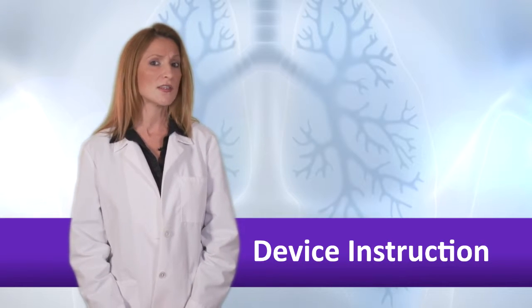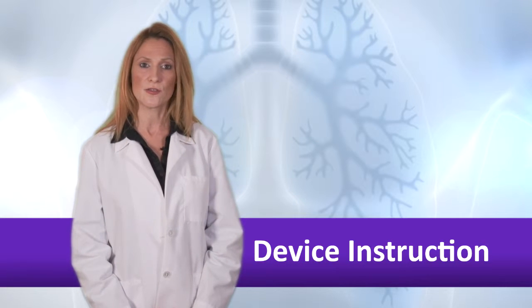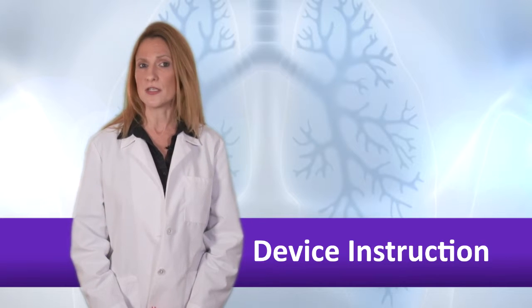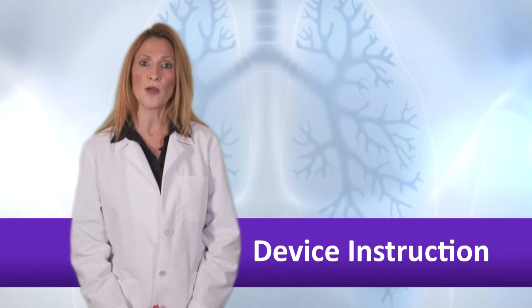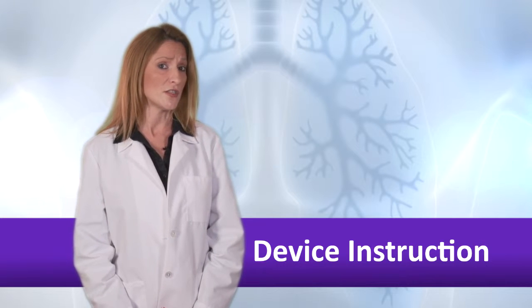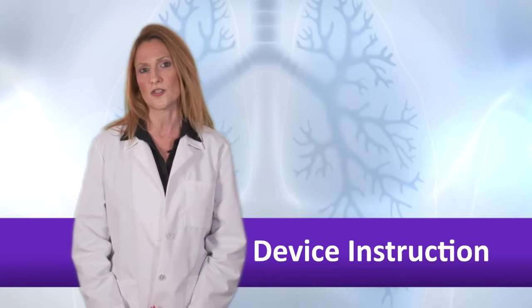Interaction with you also gives an opportunity for the patient to ask questions and voice any concerns. Key concepts can be emphasized and adapted to a specific patient's situation. Any health literacy issues can be overcome in order to deliver the information in a way that the patient can understand. Up to 30% of patients may not be able to use an MDI despite multiple attempts and instruction.